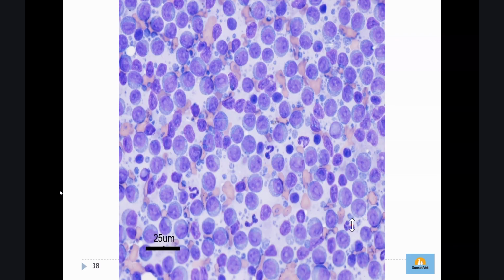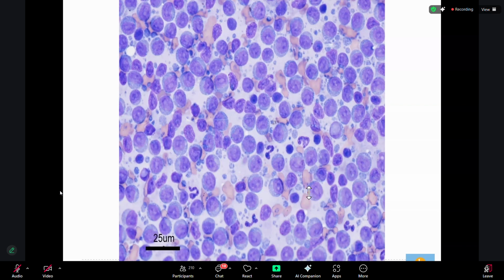But in your opinion, is it more white blood cells or more another cell that you don't know? Let's say another cell that you don't know. Yes, it's typically the other cells that you don't know. So this must not be inflammation.